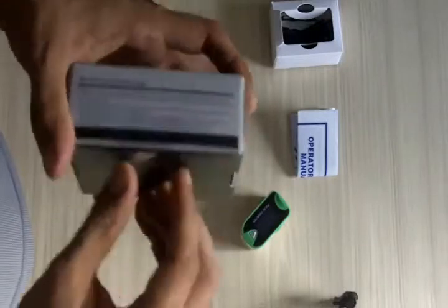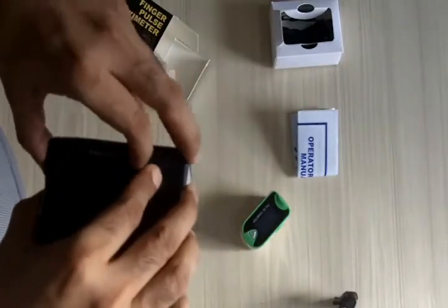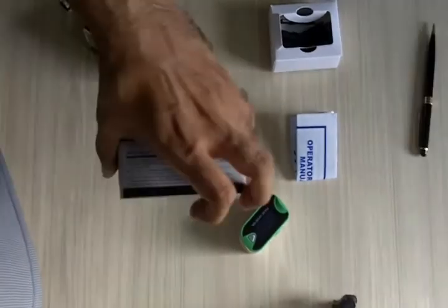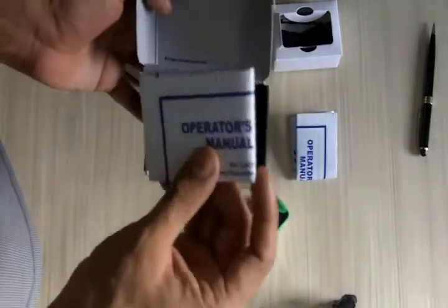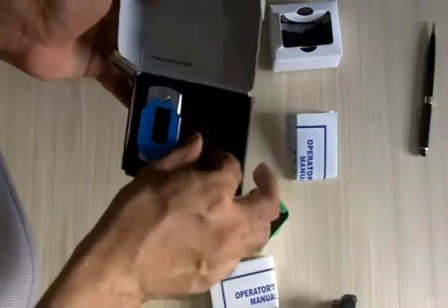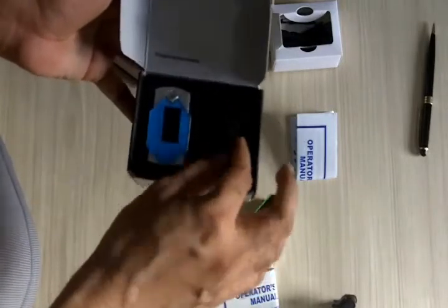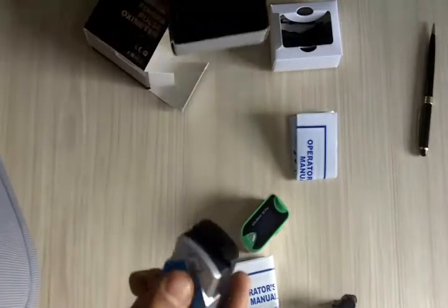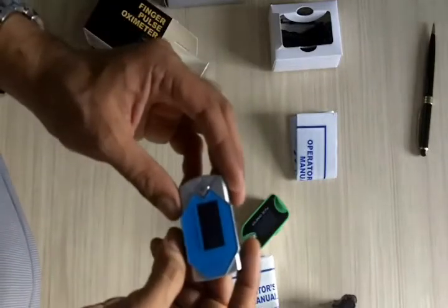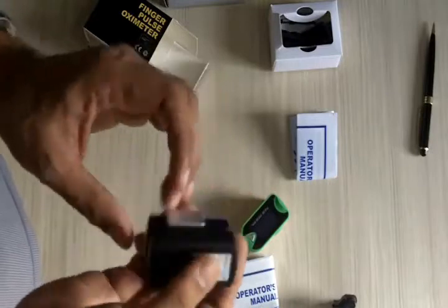Let me open one for you. This also comes with the operator's manual, two batteries, a chain to hold the pulse oximeter securely, and of course the pulse oximeter itself. The battery cover is on the backside — you just push it to open.